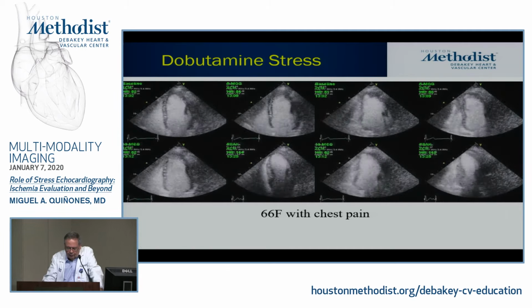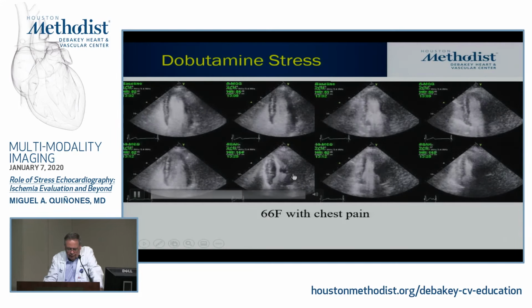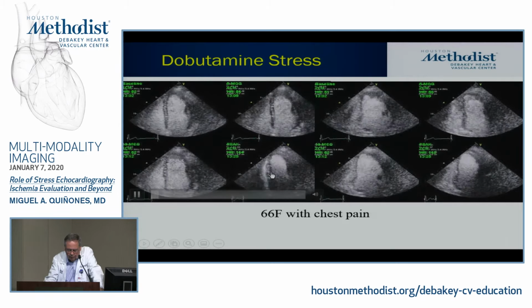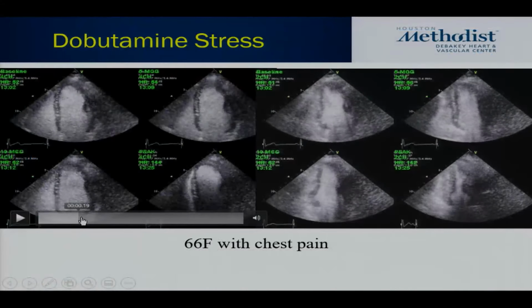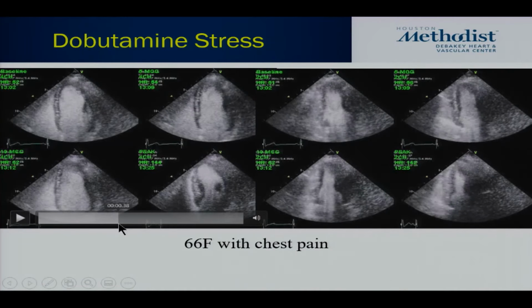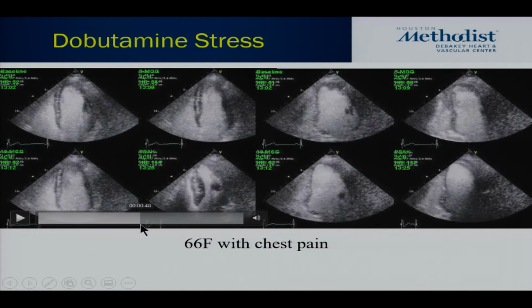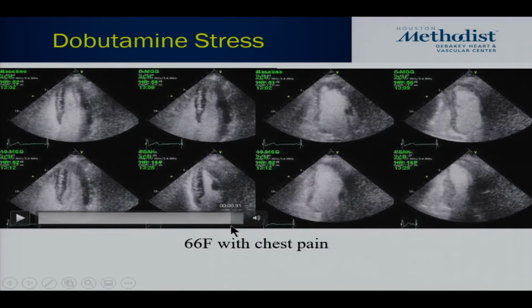All right. This is another circ. I want to go a little faster, but again, you can see very nicely how this is lagging behind. Again, note the end systolic diameter here, and watch it here. It's a little more enlarged right now. And maybe this one I can do the trick that you guys were telling me. Yeah, here we go. So look at that end systolic here versus the resting.